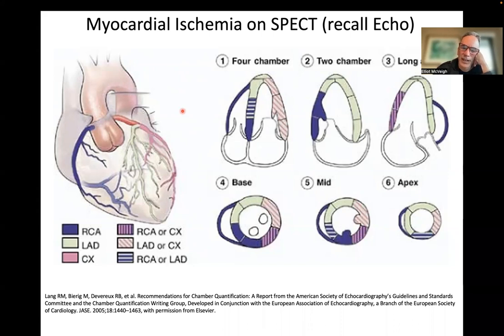we think it's the left anterior descending artery. And if we look at this, here's the LAD coming off here. So this is the left main coming out here, and then it breaks into two. It goes into the circ, which goes around the back of the heart, and the LAD feeds the front, or the part of the heart that's under the chest wall. Circ goes around the back. So does the right coronary artery. It goes all the way around the back and then feeds the posterior wall. And then those regions are color coded on here.